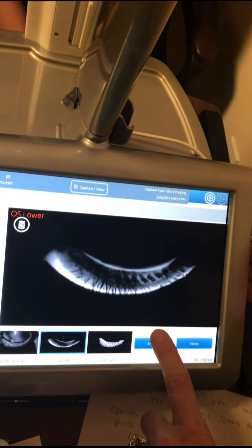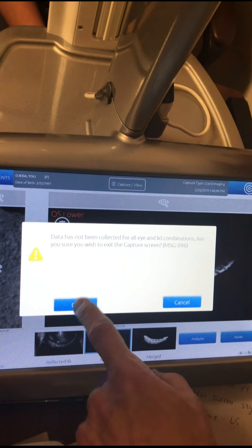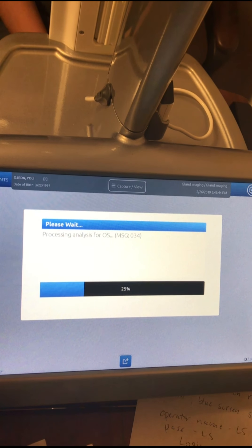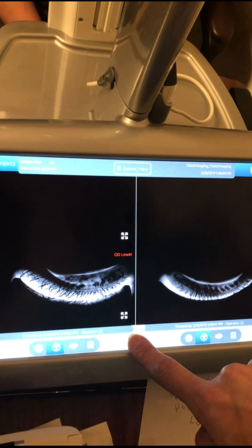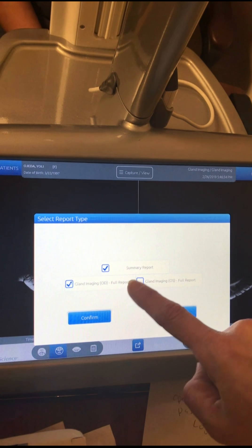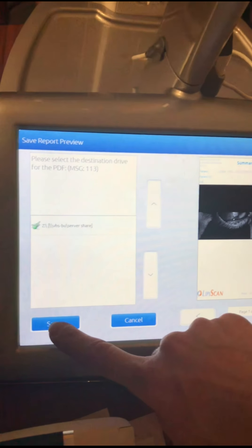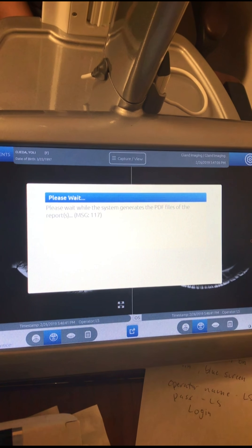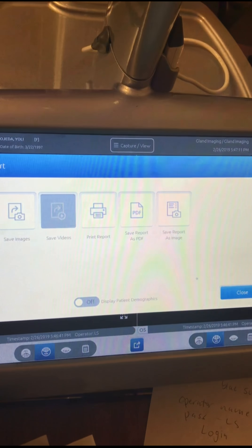Then you hit analyze. It's just saying that we haven't done the upper lids and we know that and that's okay. So I'm going to hit okay. And processing. Then we want to send it, so we're going to hit this button down here at the bottom. We're going to do save report as PDF. We need all three checkboxes clicked. Hit confirm and then save. Now it says it is complete. You hit okay and you're done.